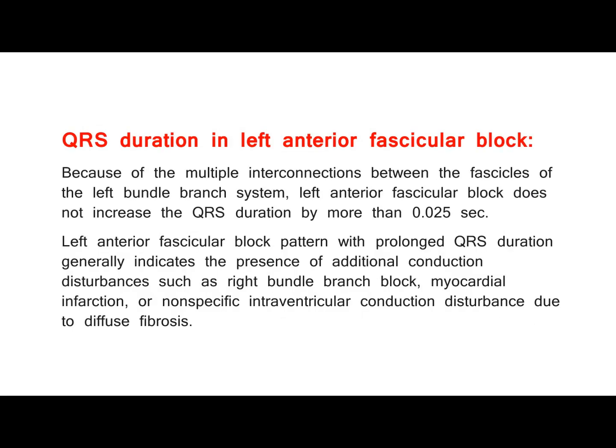QRS duration in left anterior fascicular block. Because of the multiple interconnections between the fascicles of the left bundle branch system, left anterior fascicular block does not increase the QRS duration by more than 0.025 seconds. Left anterior fascicular block pattern with prolonged QRS duration generally indicates the presence of additional conduction disturbances such as right bundle branch block, myocardial infarction, or nonspecific intraventricular conduction disturbance due to diffuse fibrosis.